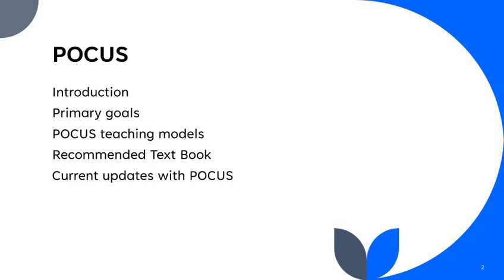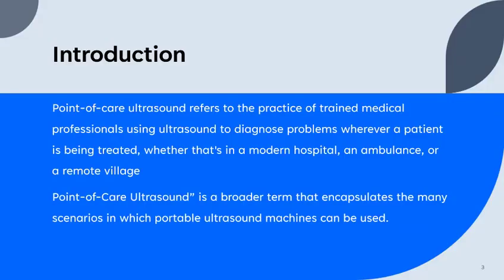Point of care ultrasound refers to the practice of a trained medical professional using ultrasound to diagnose problems wherever a patient is being treated, be it a modern hospital, an ambulance, or a remote village. Point of care ultrasound is a broader term that encapsulates many scenarios in which a portable ultrasound machine can be used.